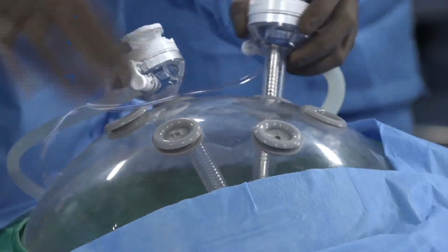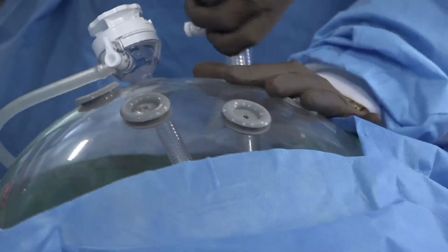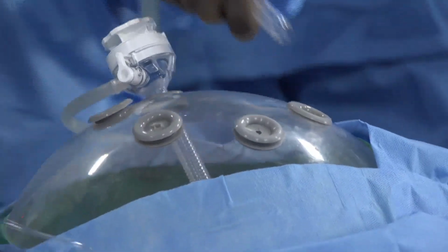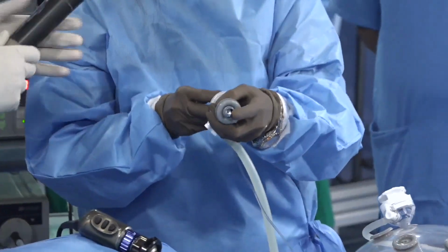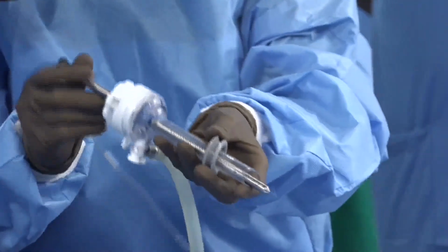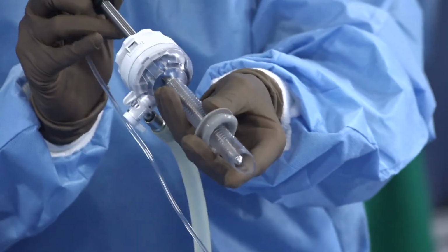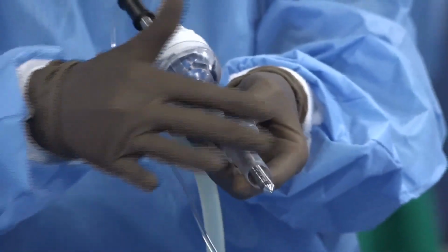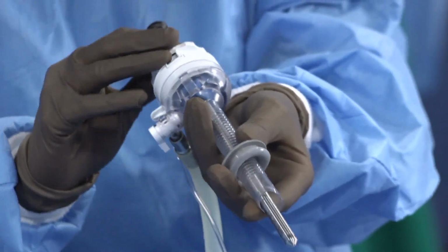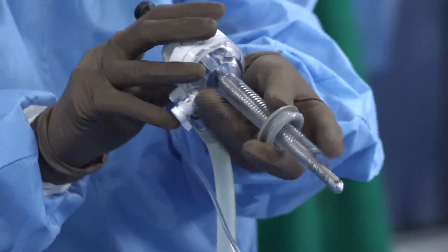And if you can't take it out, can you just hold it? So it has to be just coming out. Can you again please show, focus here, please don't remove your focus. It should not be jutting out of your port. It should not be inside the port. It should only be sufficiently outside so that the aerosol comes out. There should not be any clogging, or touching of bowel in any circumstances. Otherwise, you will have lots of problems in the post-operative period.